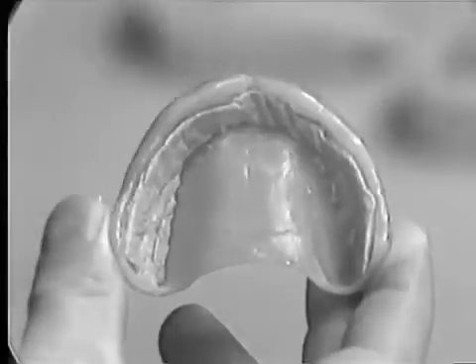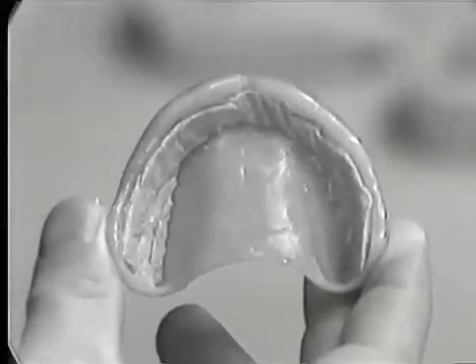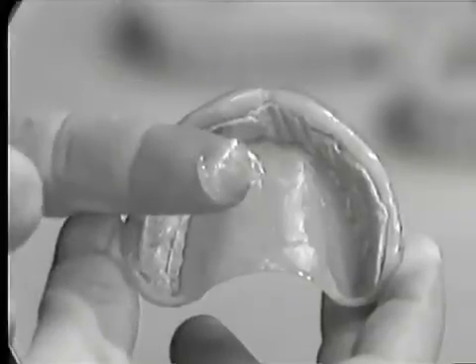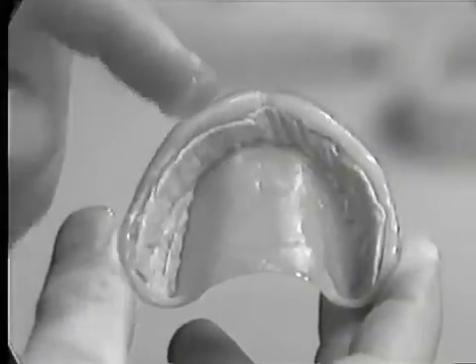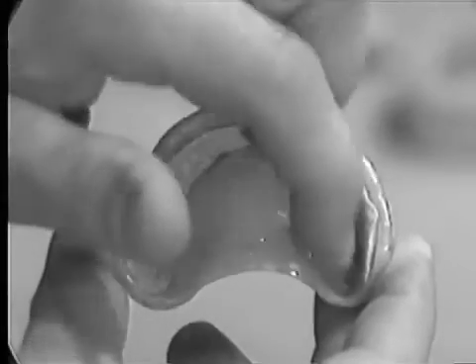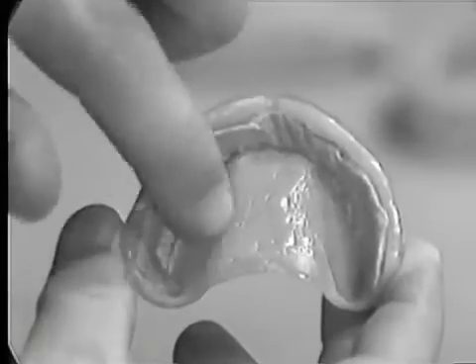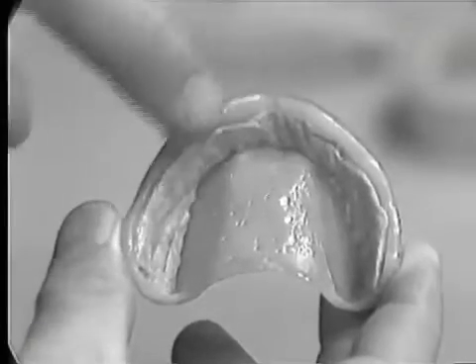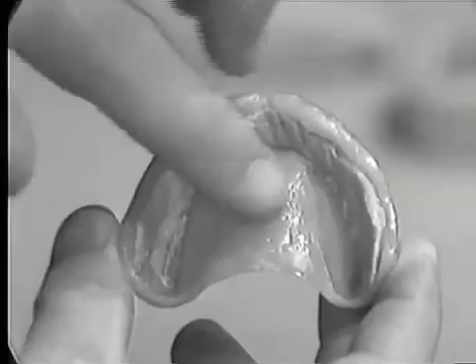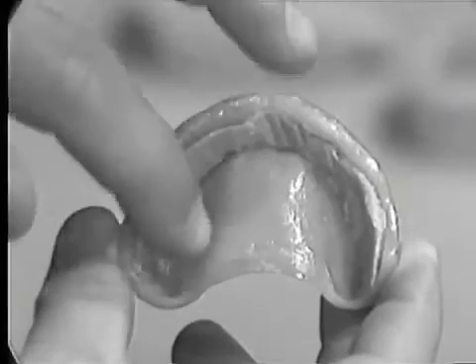After the undercuts have been relieved, the internal surface of the denture is lubricated with a suitable media. In this case, we will be using Vaseline. However, a tin foil substitute or even red soap is acceptable. It should be placed on all the tissue surface including the denture borders.